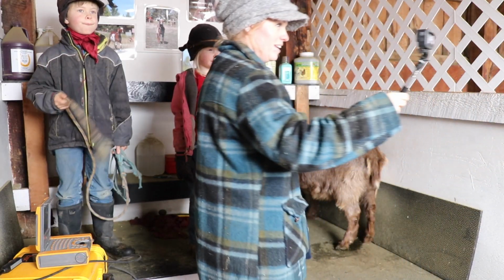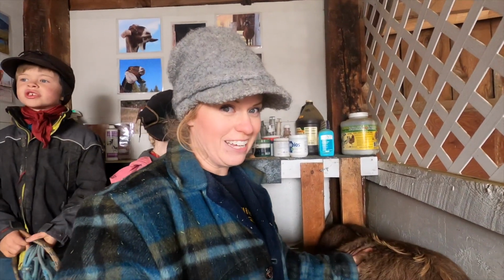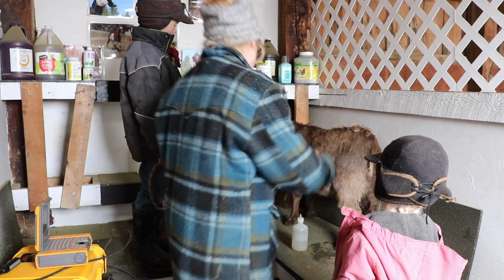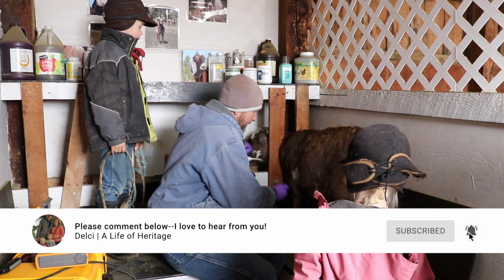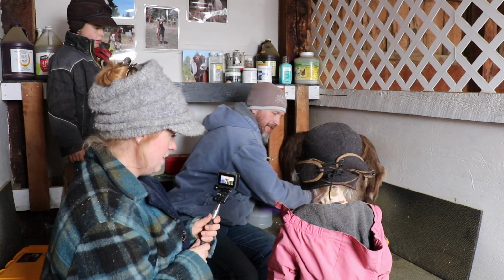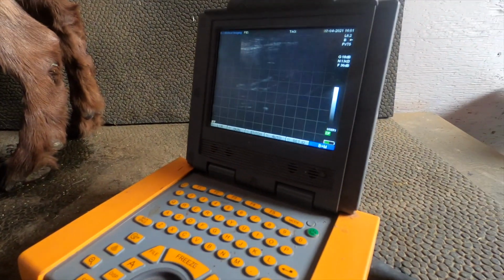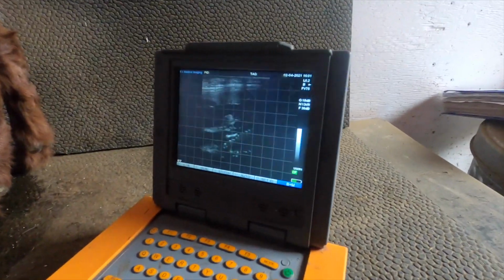So the vet just went to get some lube. We're going to get a good picture of our Opal here. She is bred, so this will be her first freshening, and it's exciting to see that she's bred. Good milker, you gotta be glad to know. It's going to be a little cold. When you're doing ultrasound, air is the enemy. I see it. That is the backbone. Right there. See if we can get you a good heartbeat.